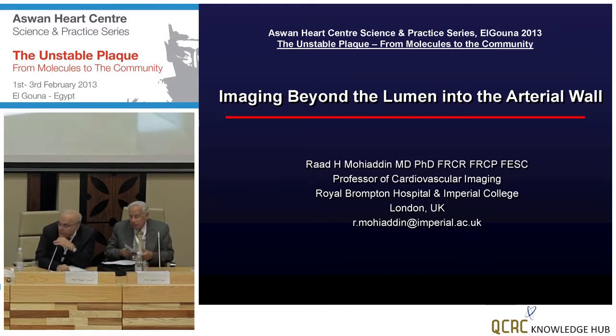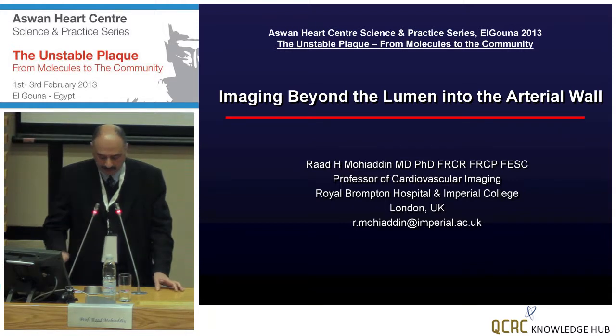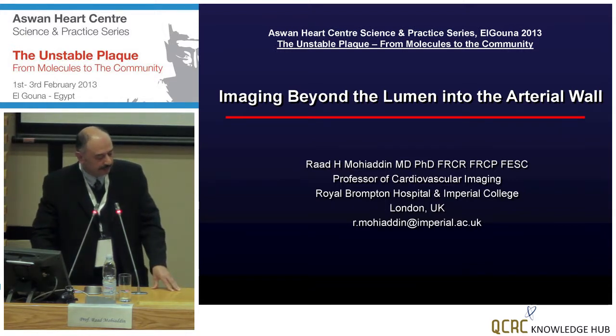Can I ask you, in trying to increase the resolution, is 3 Tesla MRI more useful than 1.5, for example? It depends where you're measuring, because getting more signal, if you're going to benefit from it, yes.